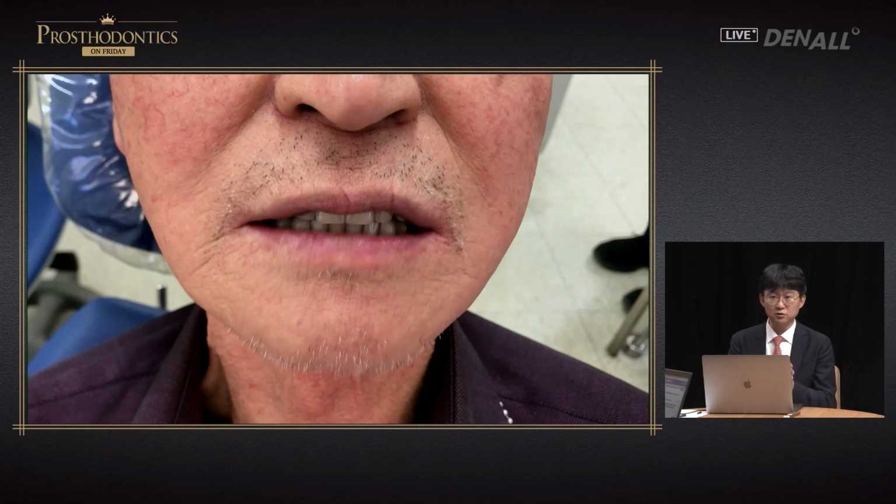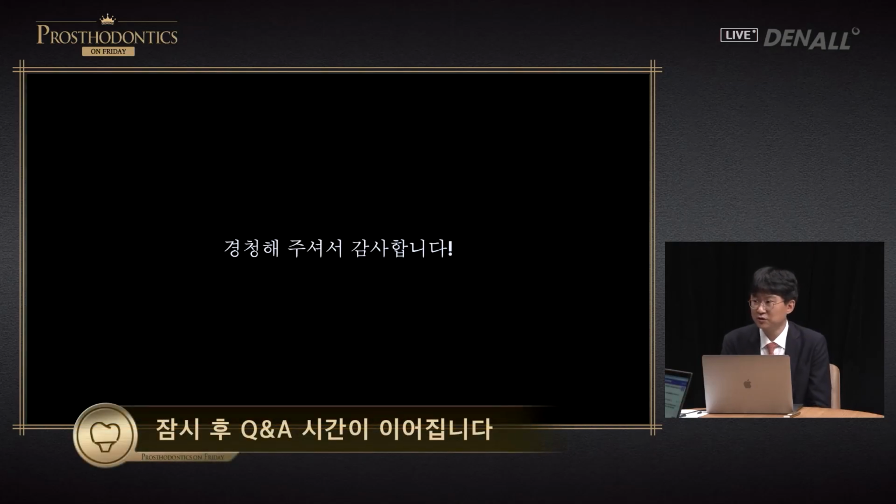Intraoral adjustment is necessary for patients with the tapping point not reaching the apex and who have abnormal movements. We need to prepare for that, and to make it easy, I use the lingualized occlusion quite a lot. I did not want to show you very easy cases, so I collected some unique patients which make up less than 5% of all cases, and I talked about how to address the problems.